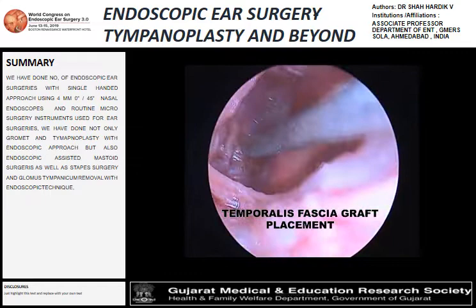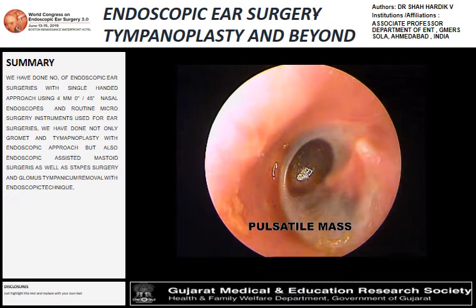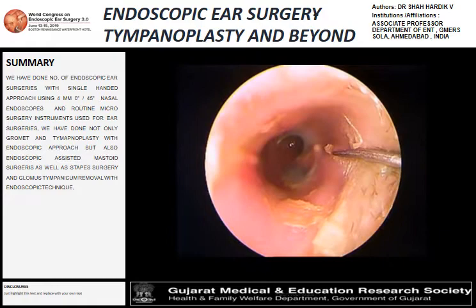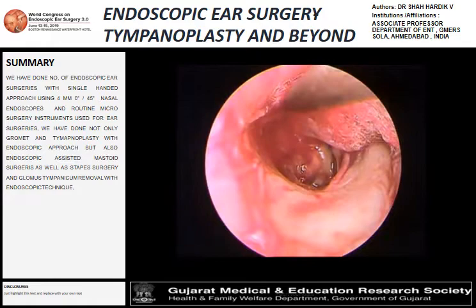By using the endoscope, we could avoid the canal wall down procedure. This patient presented with a pulsatile mass within the middle ear, pulsatile tinnitus, and MRI showing a glomus tympanicum tumor within the middle ear cavity. That's the flap elevation — the middle ear was filled with blood, which we could easily suction after elevation, and we could see the lesion attached to the jugular bulb.